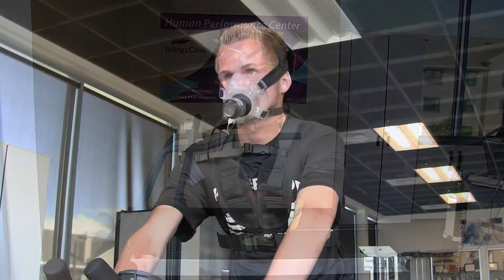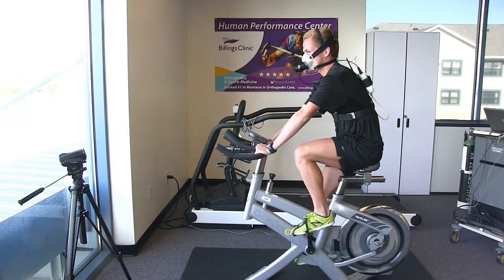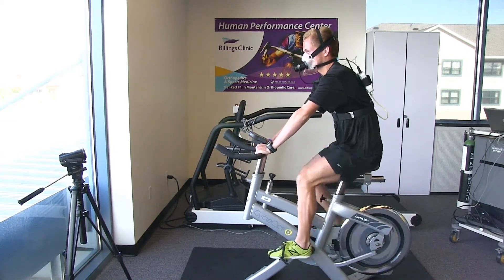Any endurance athlete can be tested for both VO2max or blood lactate threshold testing — it doesn't matter what your ability is. We have beginners running their first marathon who test, and we also have elite cyclists and runners that test as well.